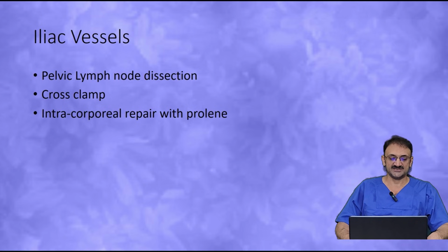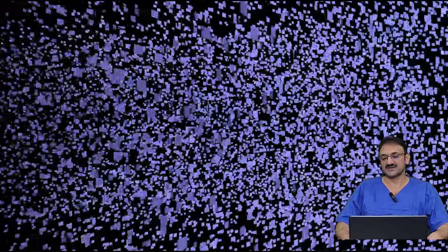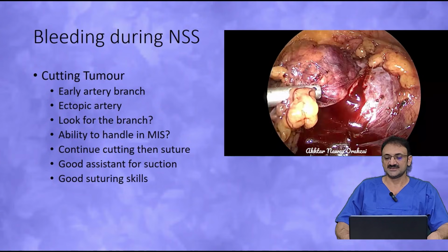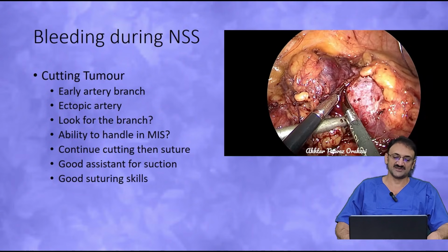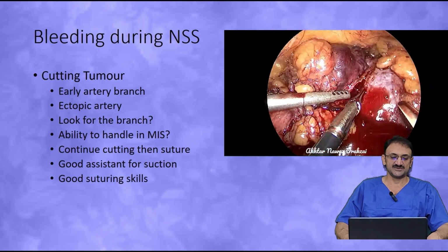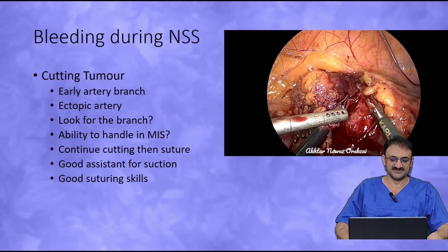So these can be injured, and a cross clamp is usually required, and they can be easily repaired with Prolene. However, if you are not experienced, you must look for an assistant or experienced surgeon who can handle it, or you can convert it as well.